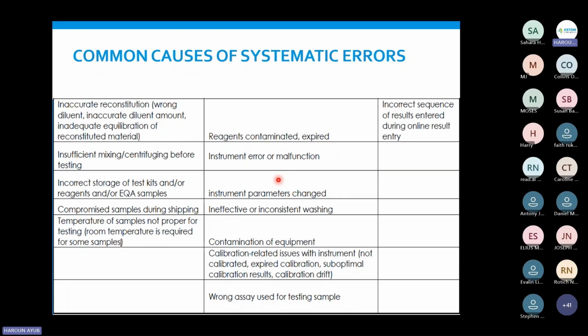For you, you come and change from 400 to 550 and 700. When you change that, definitely wrong results. When the machine was supposed to take the first reading, second reading, if you change those times and so on, it brings so many issues.